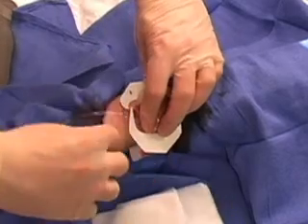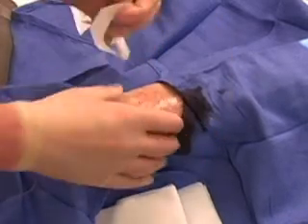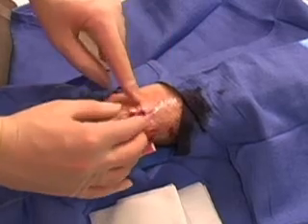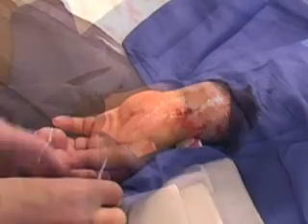There are many ways to suture the catheter in place. The key is to make sure it is secure. A clear dressing can be placed over the catheter to help further secure it.